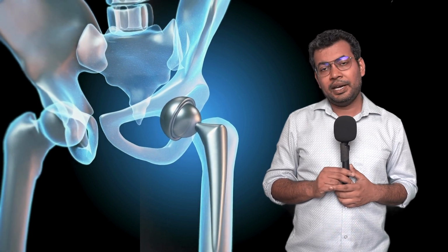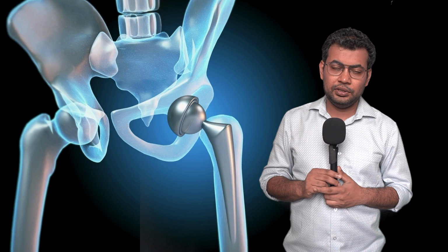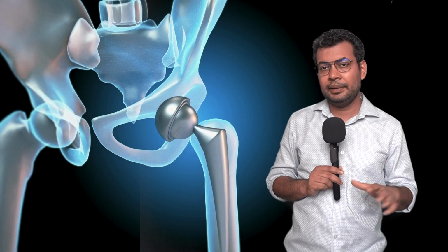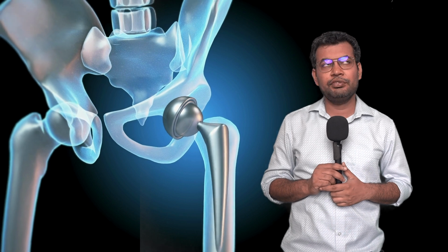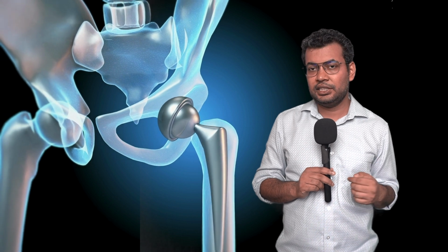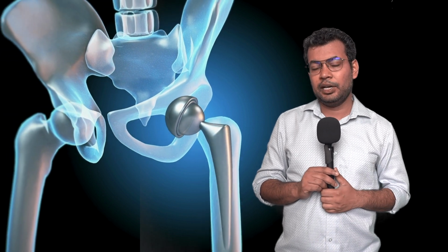So here, if we are planning for a megaprosthesis, we can use a megaprosthesis here. We do the cemented megaprosthesis with the appropriate length. If you have taken 21 centimeters, you have to reconstruct 21 centimeters of length. And after reconstruction, we have to attach all the muscles. The external rotators we tie with the Ethibond, and we attach them to the megaprosthesis.